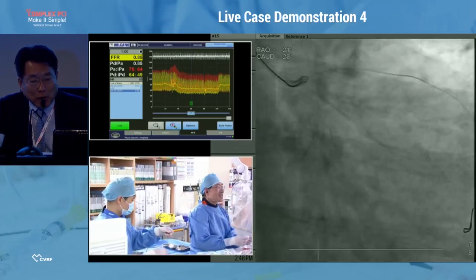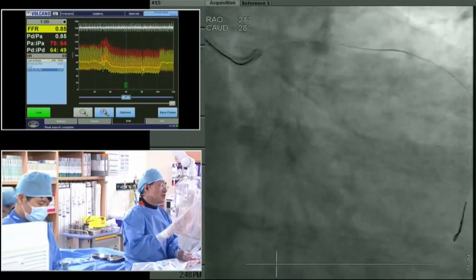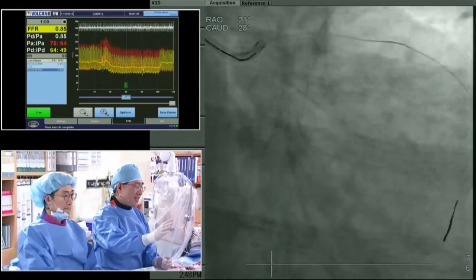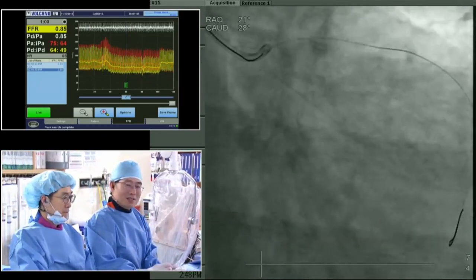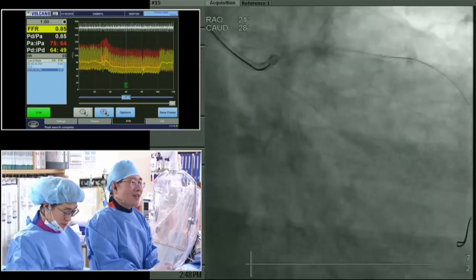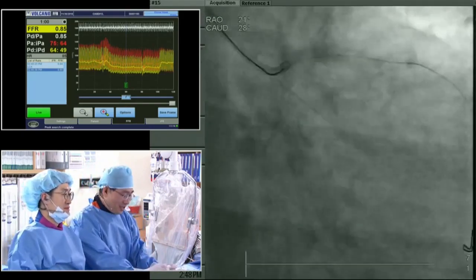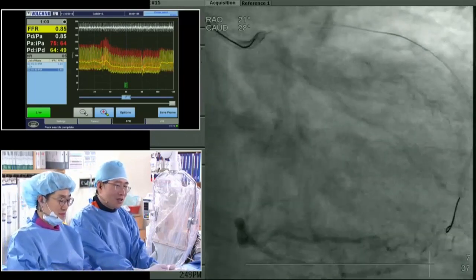Okay, so what would you do there? So as per your recommendation, I would put a stent from the mid LAD to the left main, a 35 millimeter stent, 3.5 in diameter. So that is our plan. Did you measure FFR on the LAD? LAD we did not. But LAD is also another issue, because the LAD minimal lumen area is around 4.0 square millimeters.